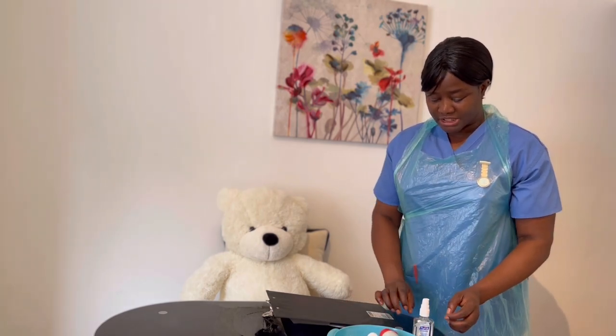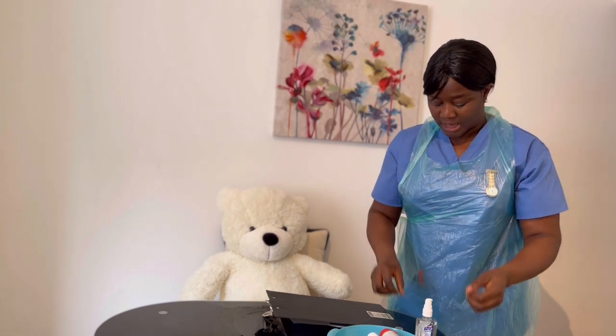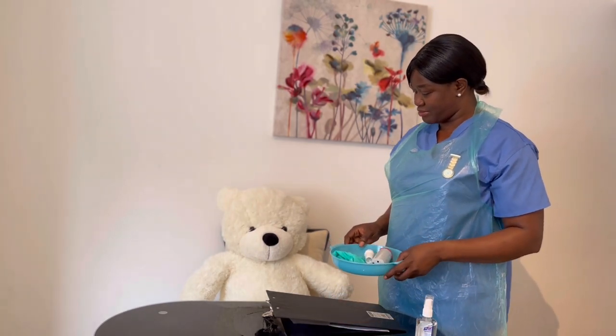I have my documents already. I will do my hand hygiene again following all the steps. I will take my materials and go back to my patient.